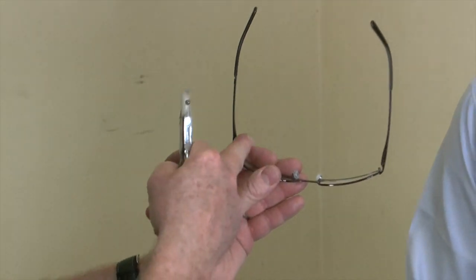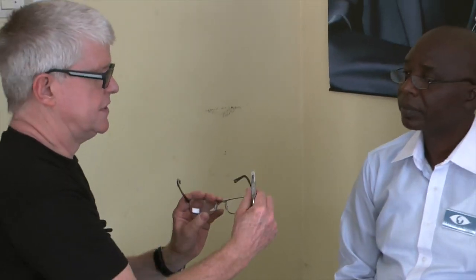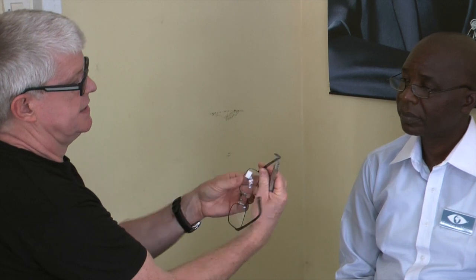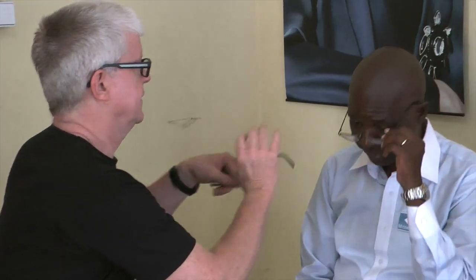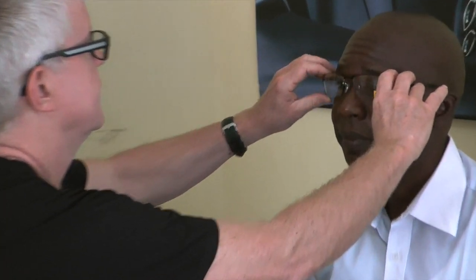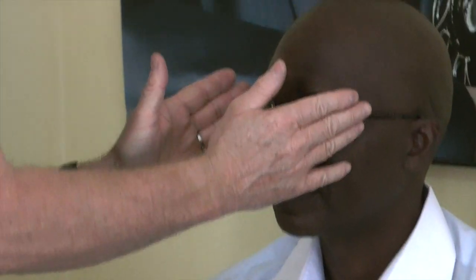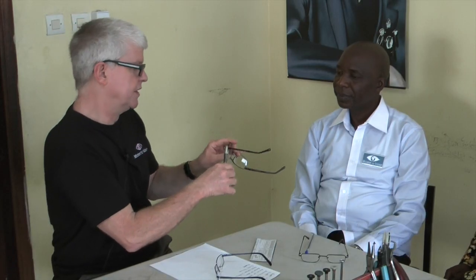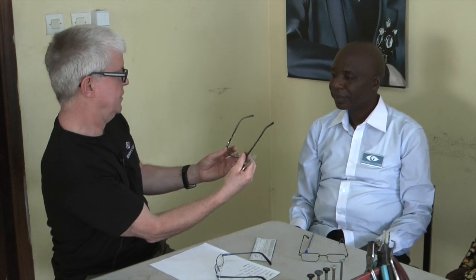It's important that the two sides are usually parallel. If you have one side that is coming in too much and one side sticking out too much so that the sides are not parallel, the frame will sit at a funny angle. If you look down, you will find that the frame is twisted. So make sure that you adjust the sides so that they correspond equally — they must be parallel.